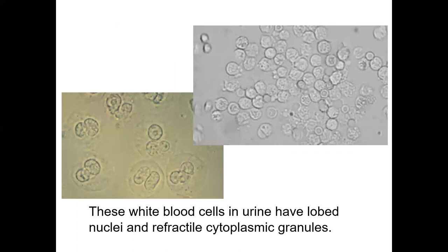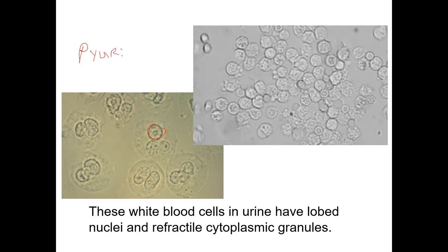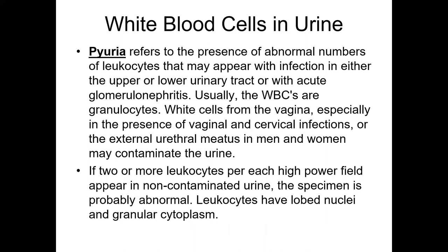These are white blood cells — you can make out a nucleus within the cells in the urine. Basically this is pus in the urine, which is called pyuria. These are cells visible within the microscope's visual field when looking at the urine — you can actually see them, not just test for them. White blood cells in the urine can be secondary to an infection such as a UTI.